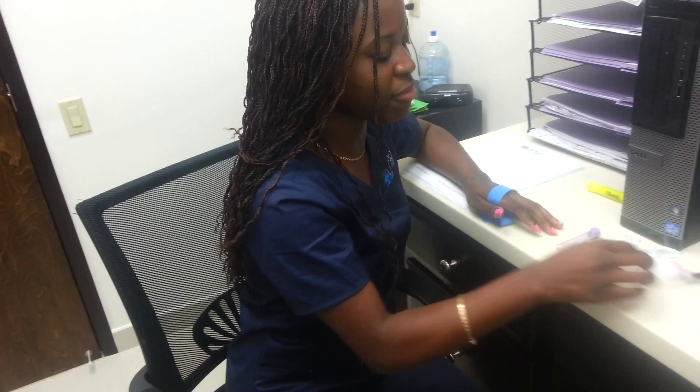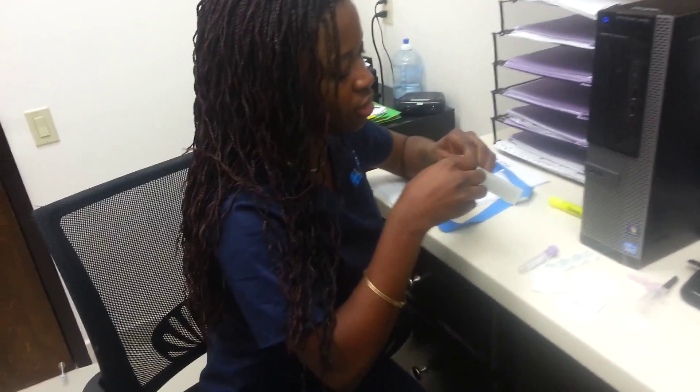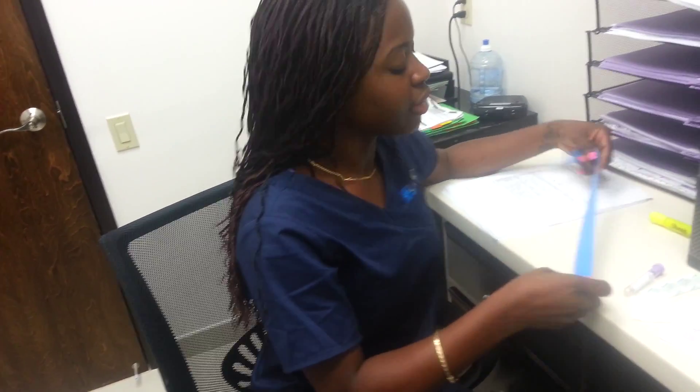Let's get this started. I have my gauze. I have my alcohol pad — let me get my alcohol pad right here in this corner. And I have my bandage. Let me preset the bandage since I will be one-handed. Alright, too much talking. I love talking. Let's get this started.